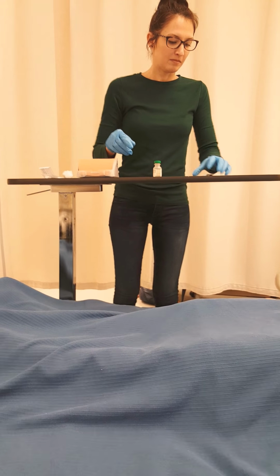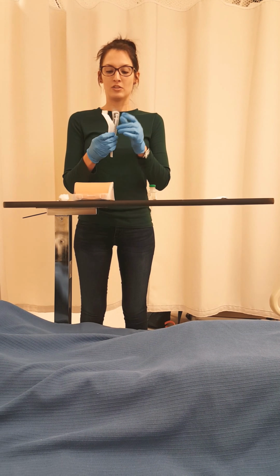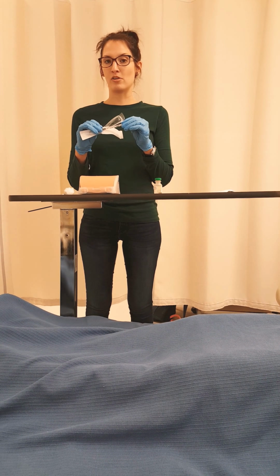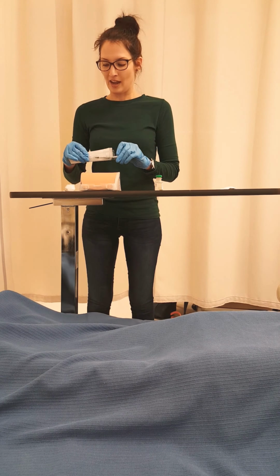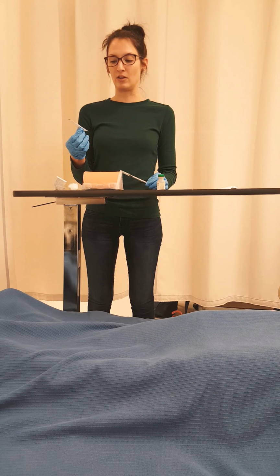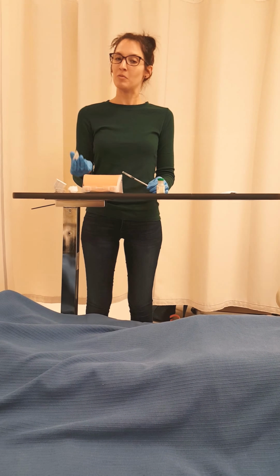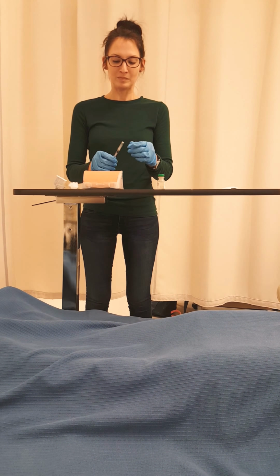Okay, so for an IM injection, we're going to have the appropriate syringe and needle sizes. I have chosen a 1 ml syringe because we have an injection of 0.4 mils. And the appropriate gauge sizes for needles are 19, 20, 21, and 22 for IM injection with length sizes of 1, 1.5 to 2 inches.